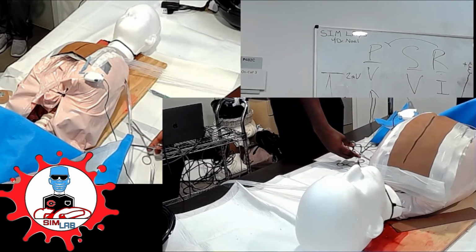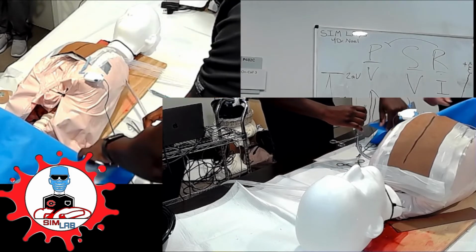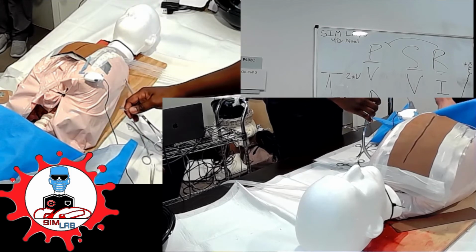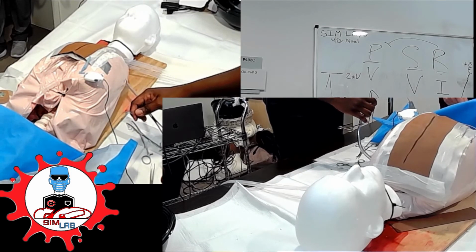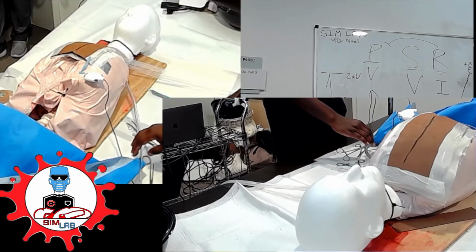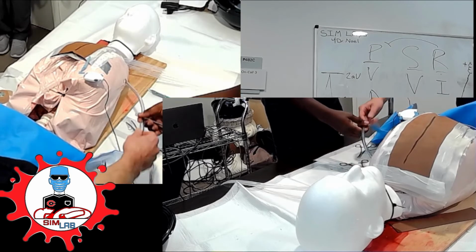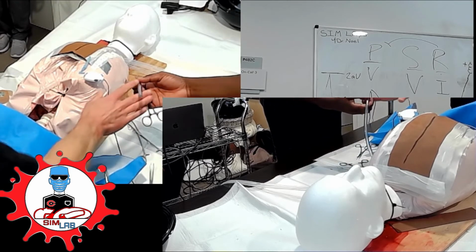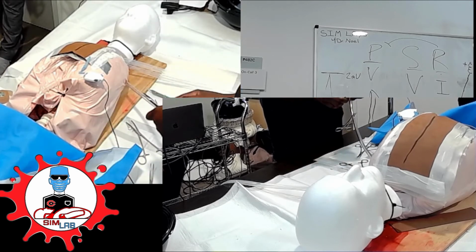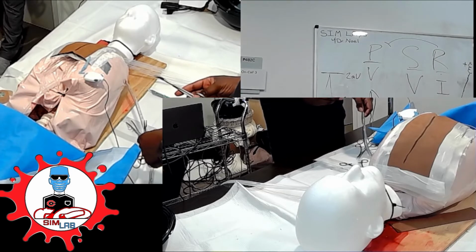So we're going to connect it. How are you going to connect it? Well, you can set up a little different pleural bag for it. Yeah, we have one. I think you put it in there. Is it on that cart? I think it's over there. So you always want to cut this thing off for the connection, right? This doesn't actually connect. You're going to cut this off and connect it there. Okay. There's one here. Sandra, there's one here. Oh, great. Thanks.